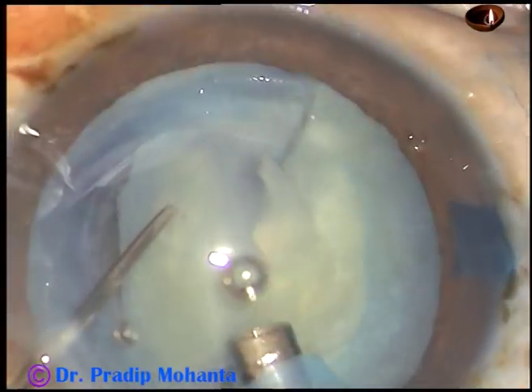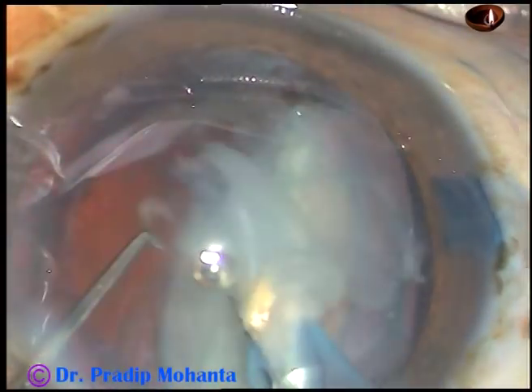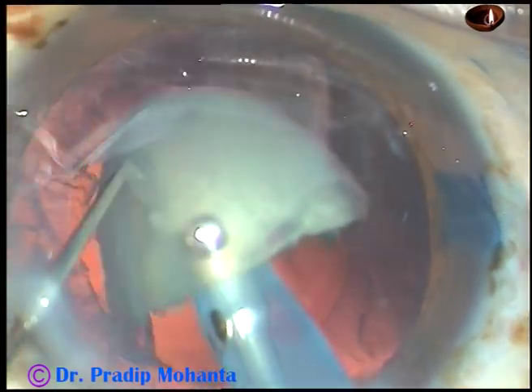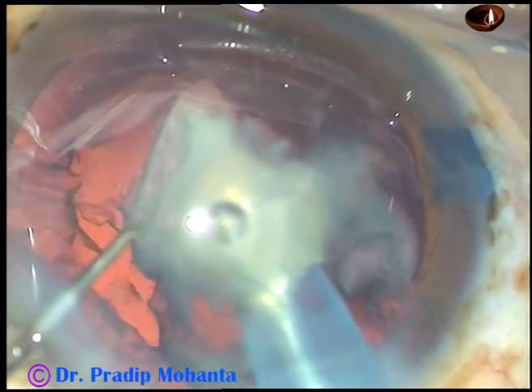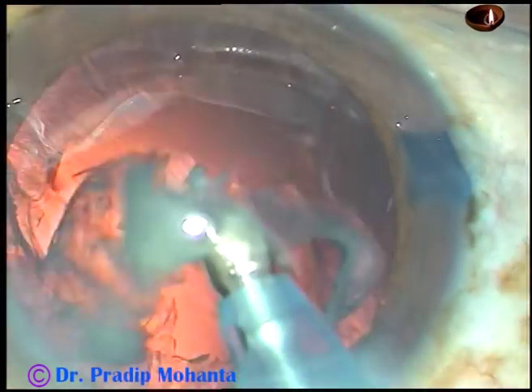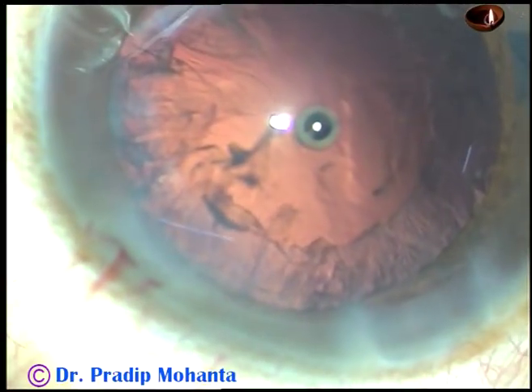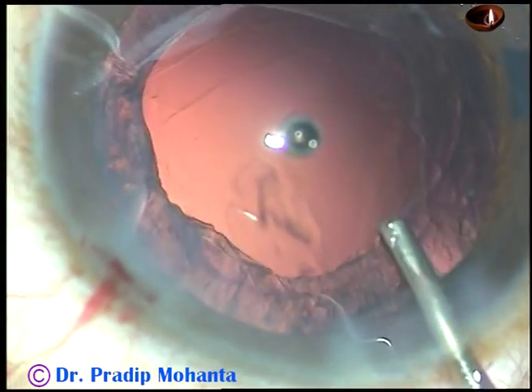This free nuclear fragment is emulsified and removed. This is the other half of the hemi nucleus — it is also emulsified and removed. The remaining hemi nucleus is chopped into two parts and each part is emulsified and removed. Phaco power used in this case is 60%, flow rate is 45 ml per minute, and vacuum is 450 mmHg. Now inject visco again to protect the corneal endothelium.